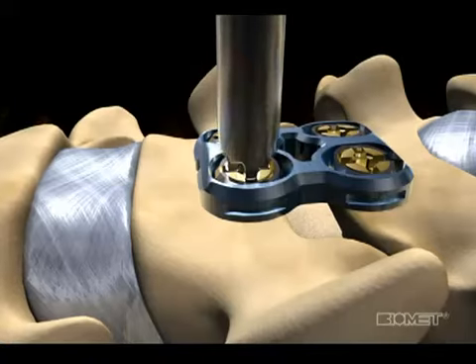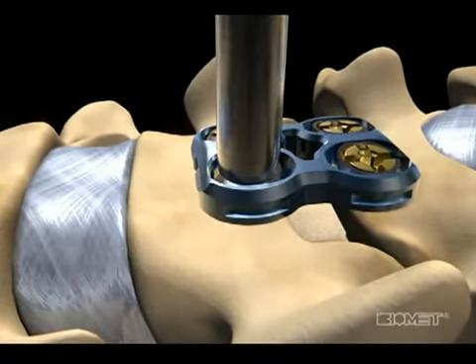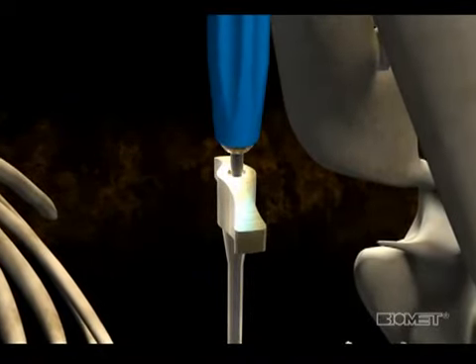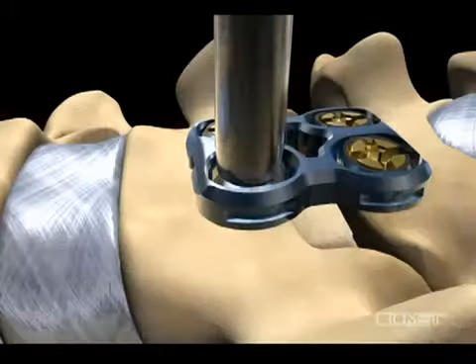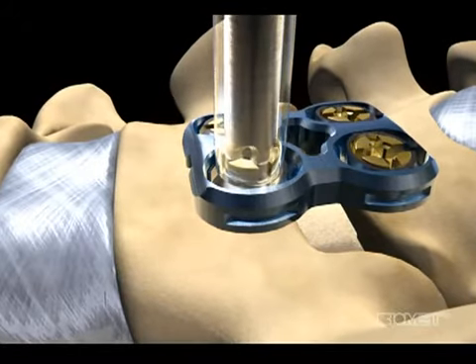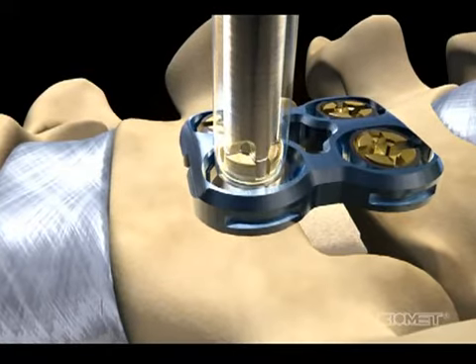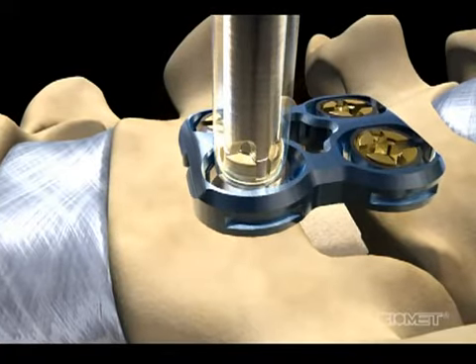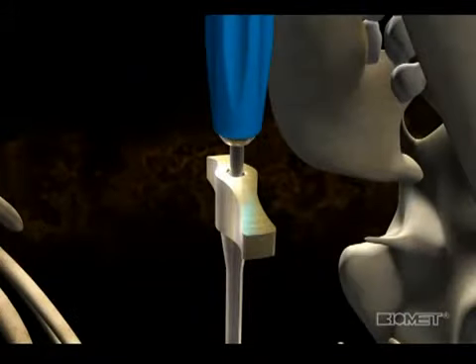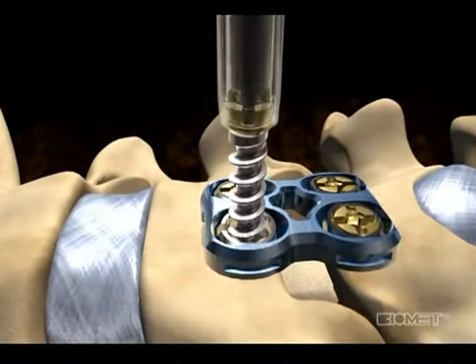Spin the screw remover sleeve down only until it makes contact with the ring, but do not tighten. Hold the gold handle of the remover sleeve steady while turning the blue handle counterclockwise. This action holds the ring steady while allowing the screw to back out past the capture groove in the ring. Once an audible click is heard, the screw is no longer captured to the plate, and the remover sleeve no longer needs to be held. The screw inserter remover can now be fully turned counterclockwise to back the screw completely out of the bone.